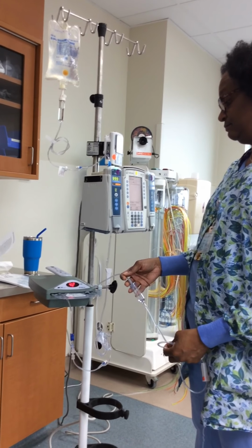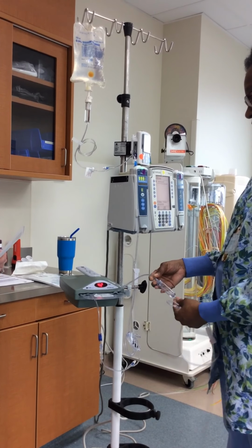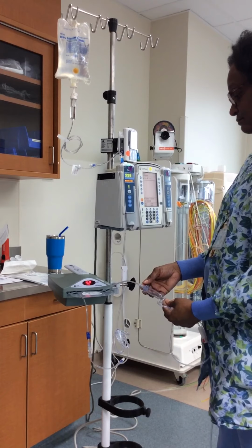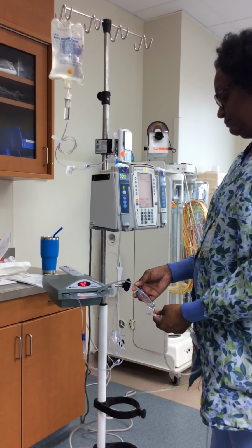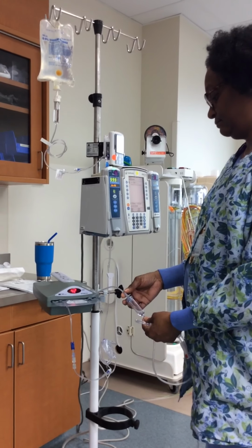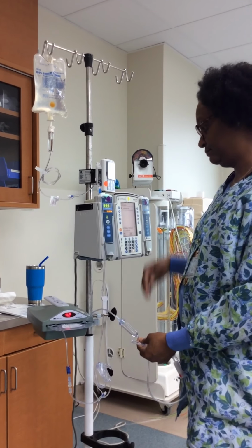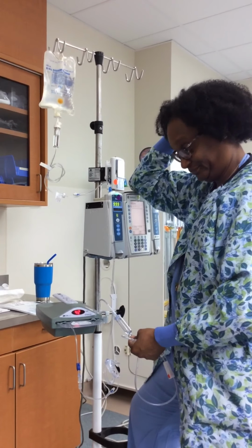When the fluid primes through, you'll see it coming towards the bubble trap that Keisha's holding onto there. When your fluid does get that far, you're going to invert the bubble trap and completely fill the chamber. When the chamber is completely full, you'll turn it upright and place it into the holder, and then continue to prime to the end.